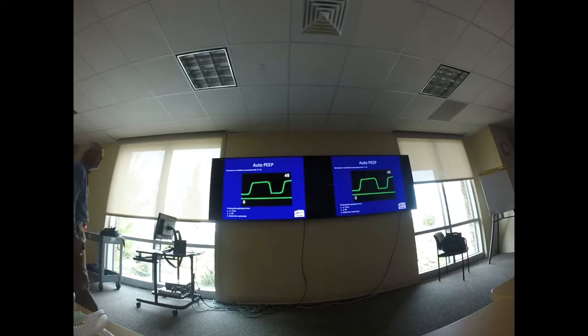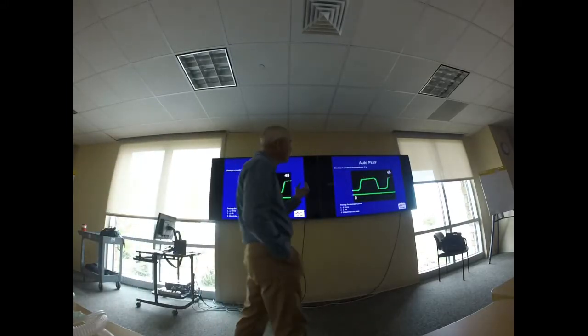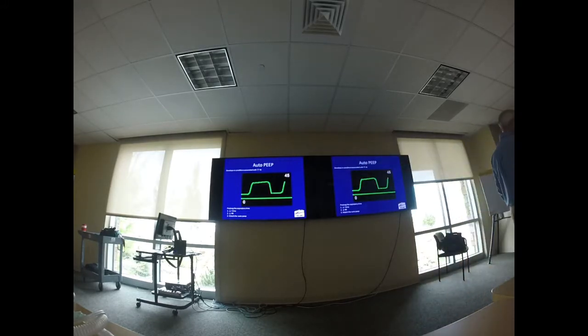All right, so maybe chronic obstructive pulmonary disease, you might see auto PEEP, and really in any condition associated with an increased minute ventilation, right? So Jason, you said there were some things that Scott did to decrease or increase expiratory time, right?